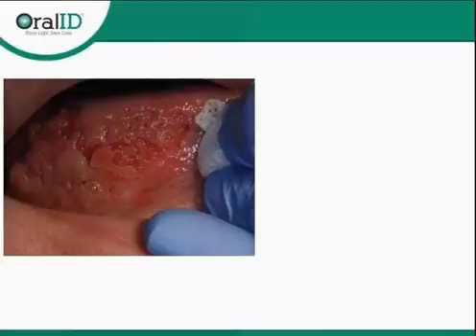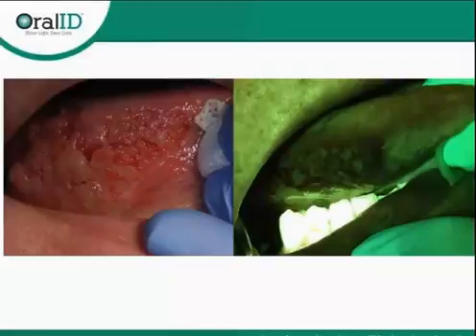Well, the patient continues to come in every 6 months, and there's no change, and there's no change. And then after 3 years of that routine, patient comes in, and it looks like this. So it almost looks like it just blew up overnight or within a short 6-month period of time. But in reality, this is something that's been developing from day one, from the very point in time that the doctor had seen something. And so had he had fluorescence, maybe he would have seen something larger under the surface that he wasn't really in tune to with the white light exam. Also, had he had a cytology test, he could have, in a non-invasive manner, just to be safe, made sure that that little bitty thing that he had seen was nothing.